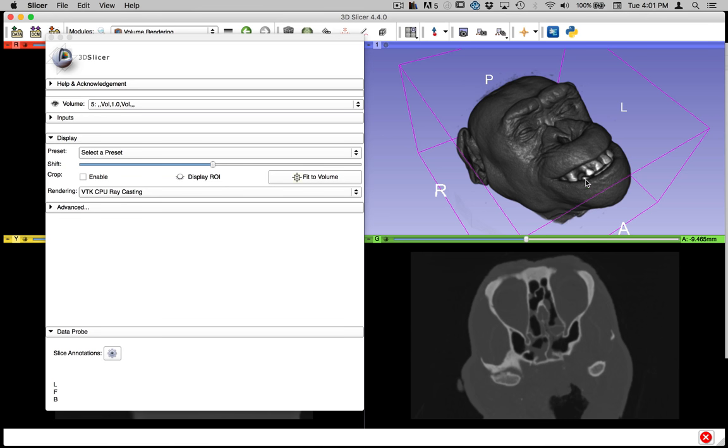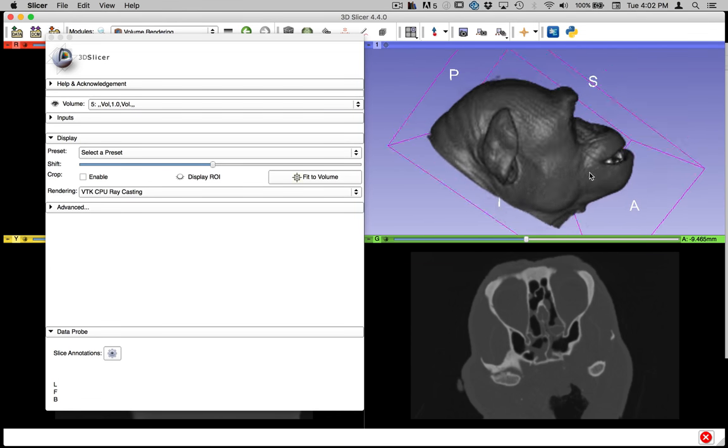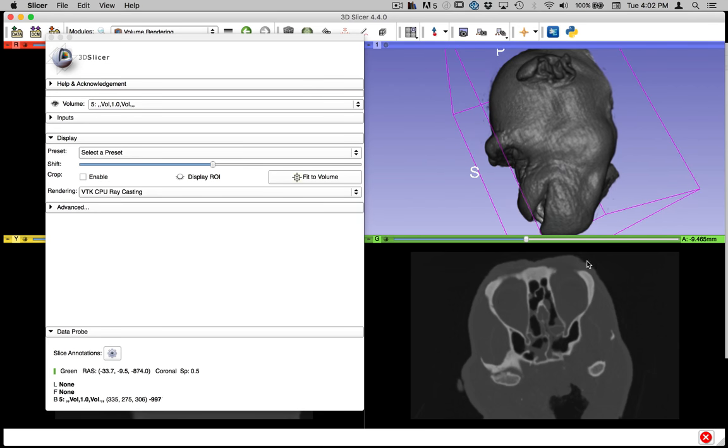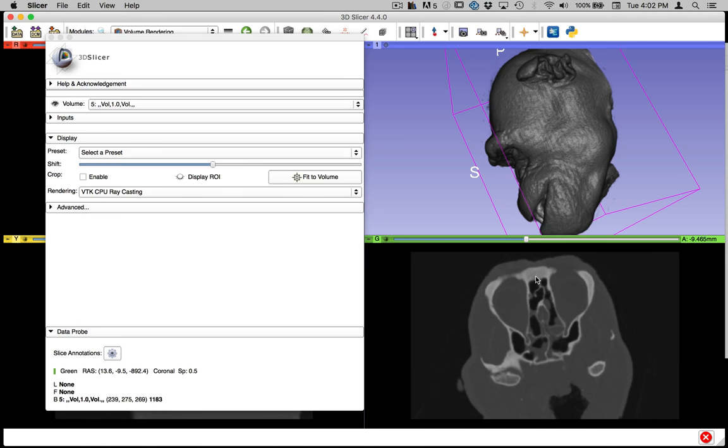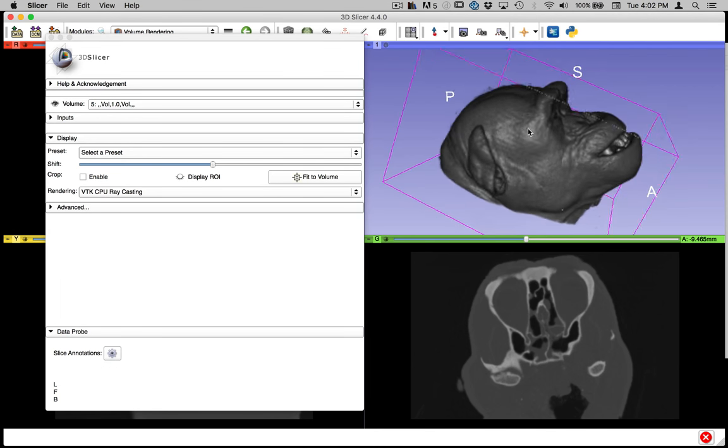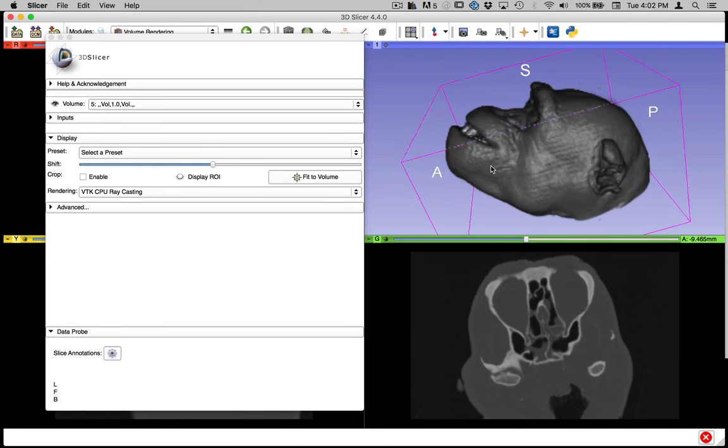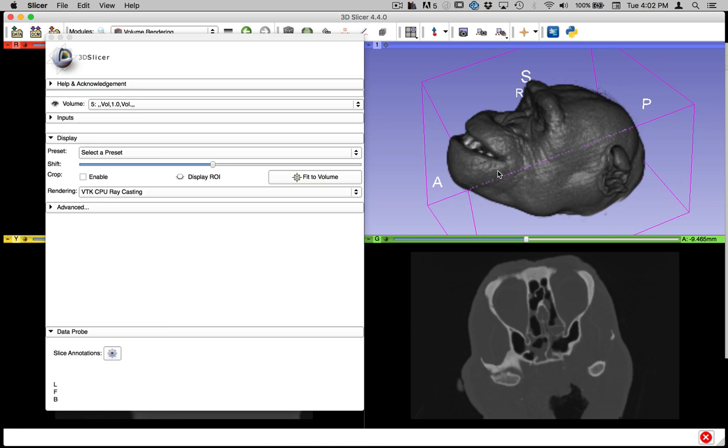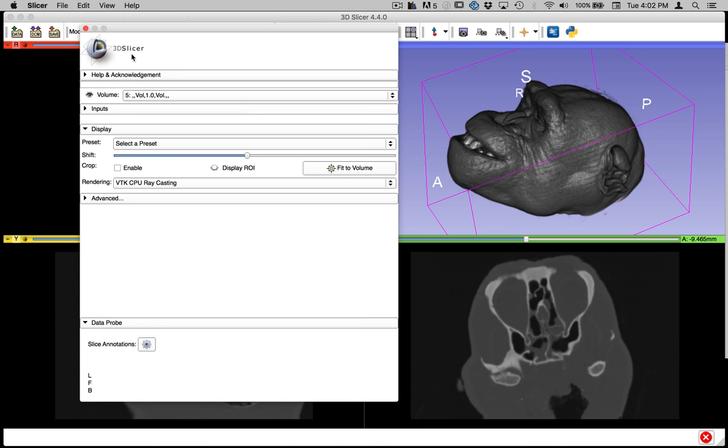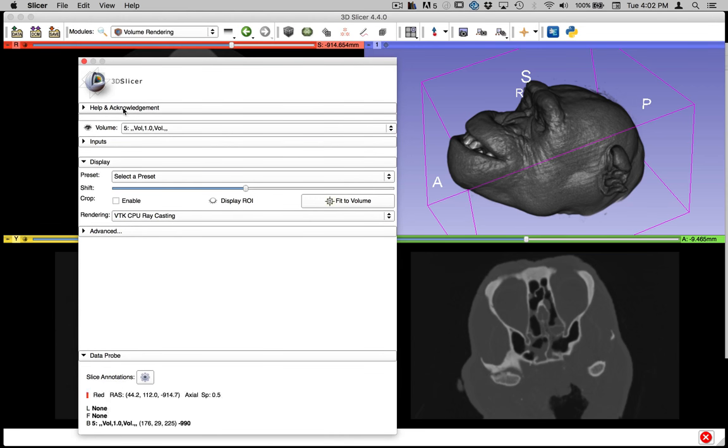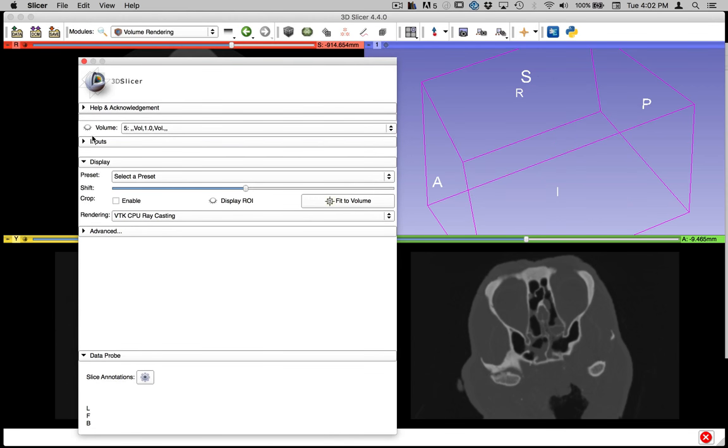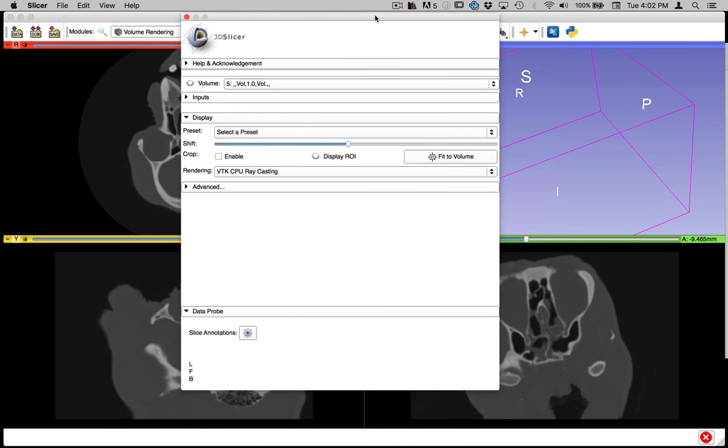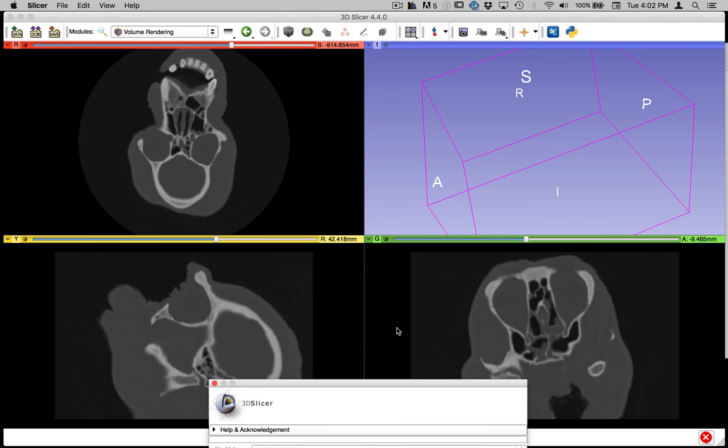So one thing to know is that this is not the model that we extract. This is a representation of what the model can look like while we're working. What we're going to do instead is to pick out the different areas of very dense voxels in these 2D representations. This volume rendering is useful just to see what we can get out of the model. And in fact, we don't even need to have this turned on after a while if it's causing your computer to lag. If you want to turn that off in the volume rendering module, just turn off the eyeball again. So when we come back, we're going to look at the segmentation process. Segmentation is picking out areas of differential density and marking them off with different colors.